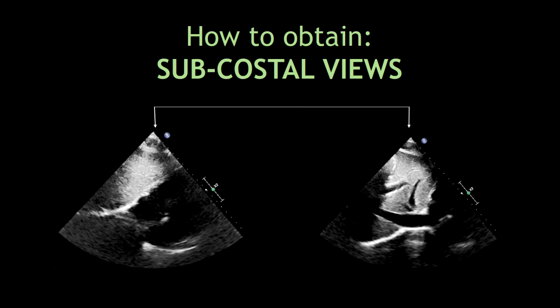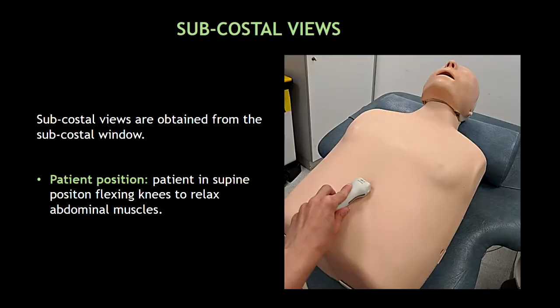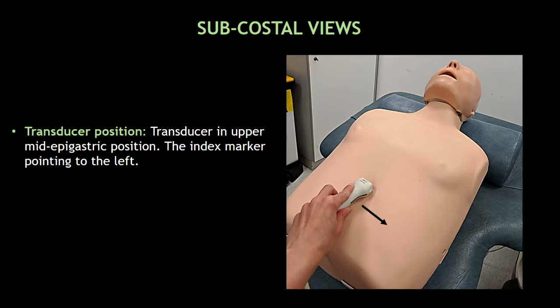Hello guys, in this video I'm going to show you how to obtain the subcostal views. Subcostal views are obtained from the subcostal window. The patient has to be in supine position, flexing knees to relax the abdominal muscles. Place the transducer in upper mid-epigastric position. The index marker has to be pointing to the left.